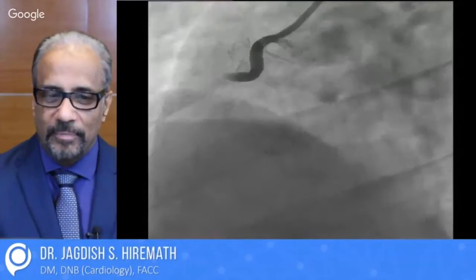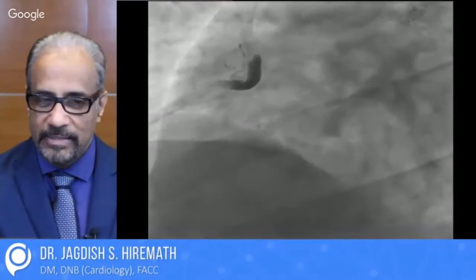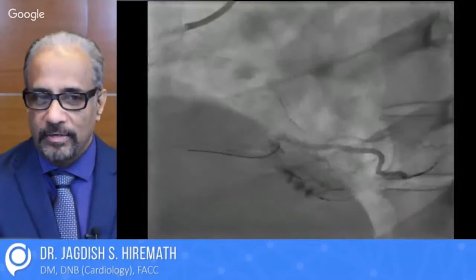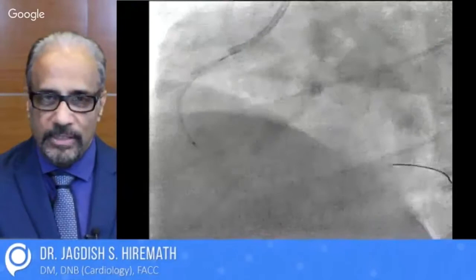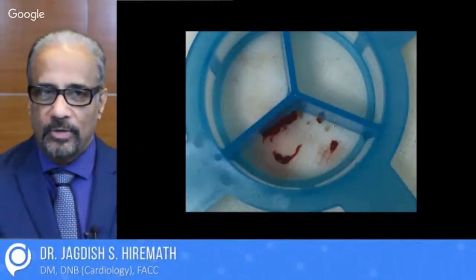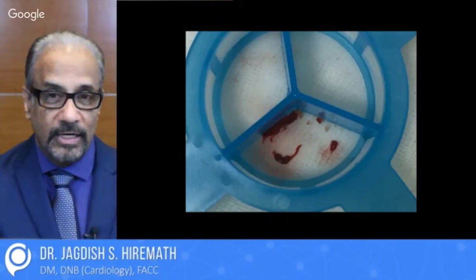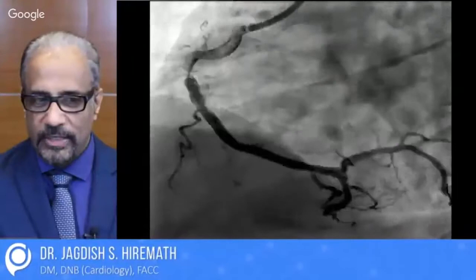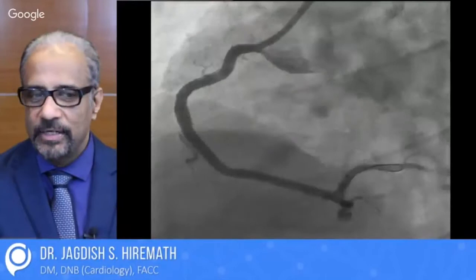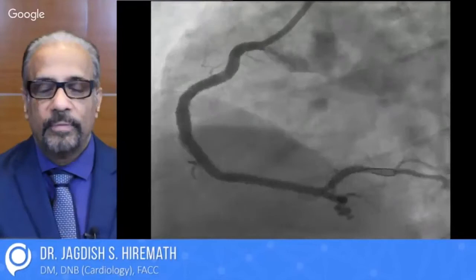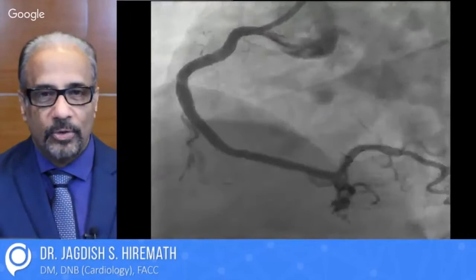This gentleman was an ENT surgeon, just 43 years of age, who came with acute inferior wall myocardial infarction — you can see the artery is completely cut off. The moment the wire was passed down, the artery started flowing, but you can see a big chunk of thrombus — a negative shadow — near the bend. It was sucked out by a thrombosuction device. The clot is about two to three millimeters but it had blocked the artery and caused myocardial infarction. After thrombus suction, there is a discrete lesion seen but no thrombus, making it easy to stent. The inferior wall was saved and the long-term prognosis is good — door-to-balloon time was less than 90 minutes and the result was perfect.